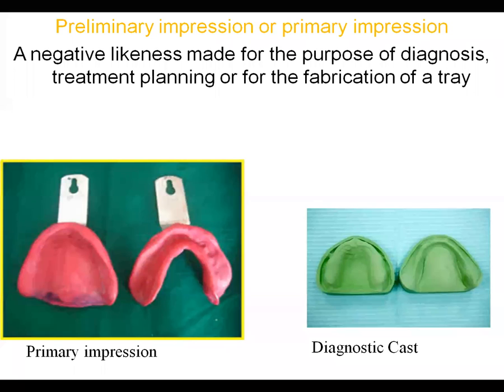Whatever Google shows you, for your diagnostic cast or for your primary impression, all images are not correct. For that, you should read the textbooks. You should read the books, and accordingly we have to perform.